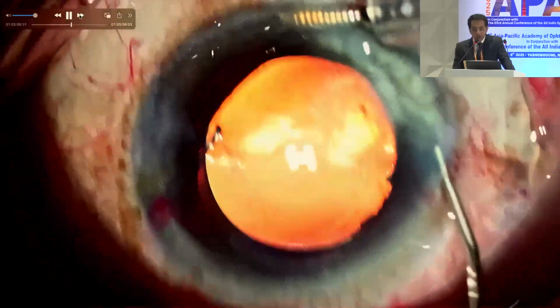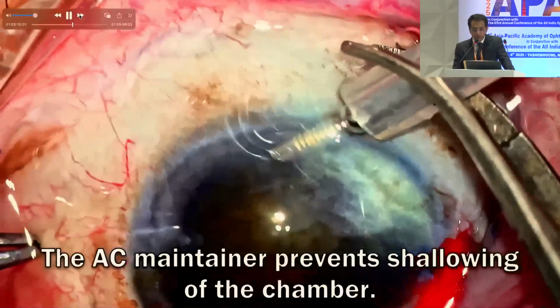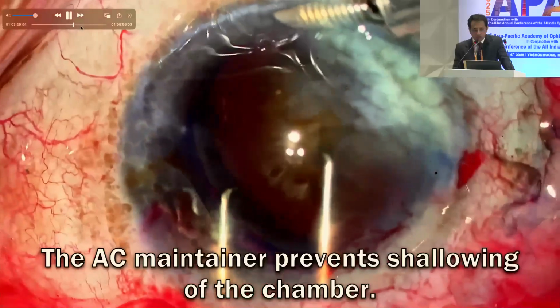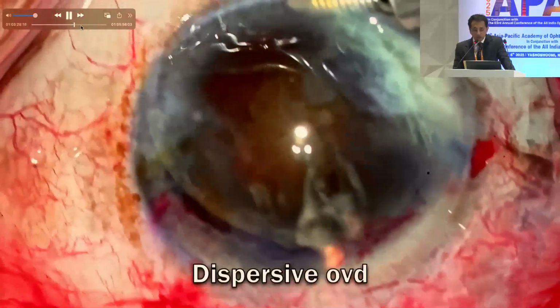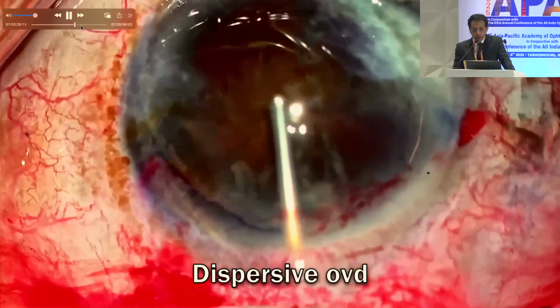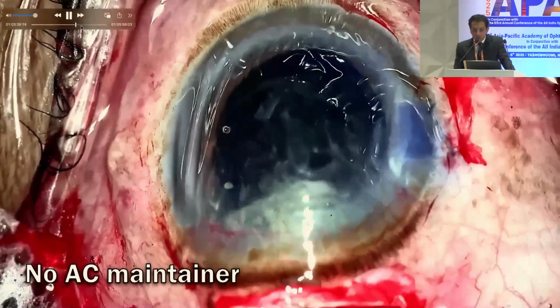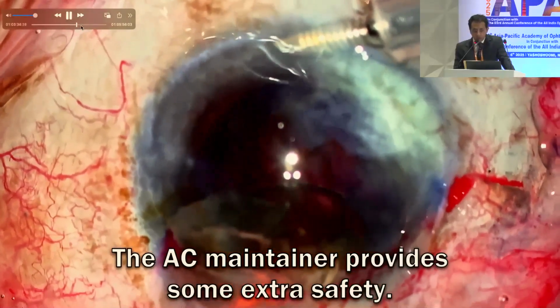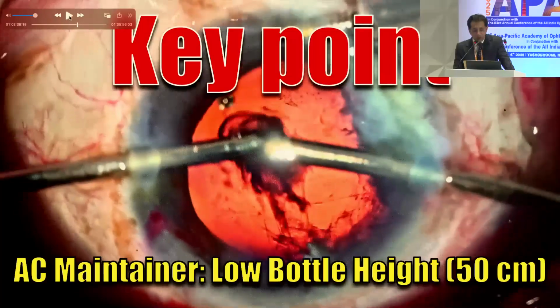Maybe there are many pioneers here who have used the AC maintainer in a better way and for longer than me, but I find this helpful, and it is what I've been doing for the last year or so. During this step, it is done under dispersive OVD only, during extraction of the nucleus. If there is no AC maintainer, the chamber is going to collapse at this stage, but if you keep the AC maintainer on, it prevents the collapse of the anterior chamber.